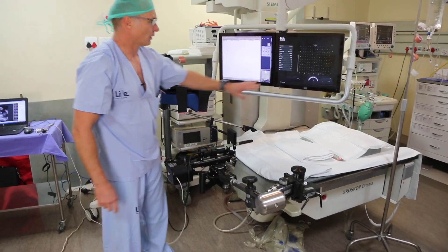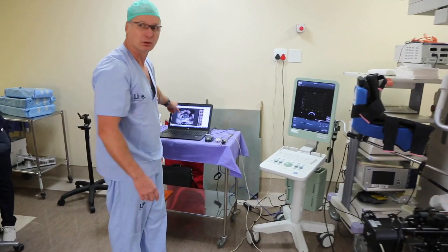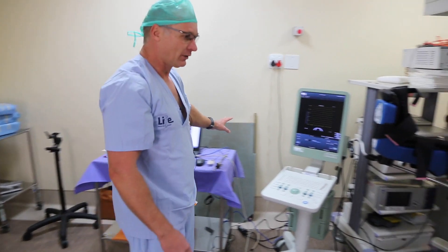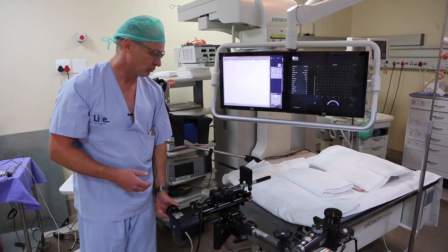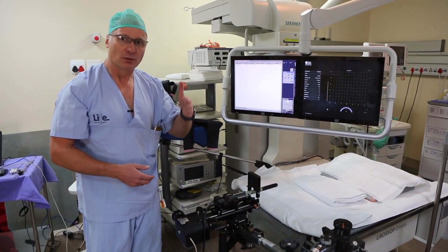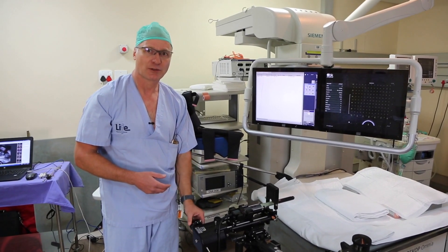This correlates with the picture. This is the ultrasound picture itself and it is transferred to the planning computer. This is a previous patient's ultrasound — we obviously don't have a patient here. What we do then is we capture the prostate. The ultrasound can move in certain directions and it's got different views, so cutting it up like a loaf of bread, we can capture the prostate in its different settings.